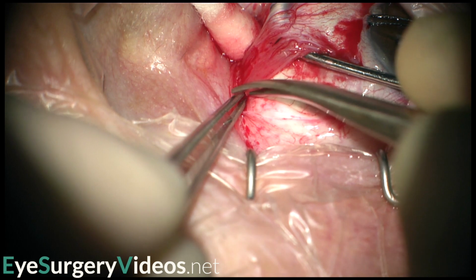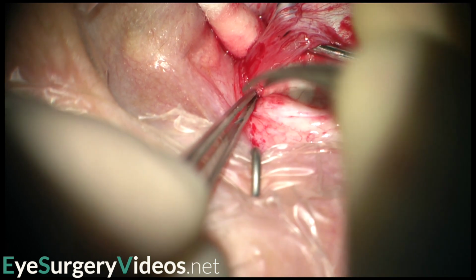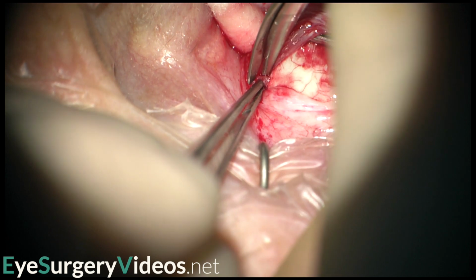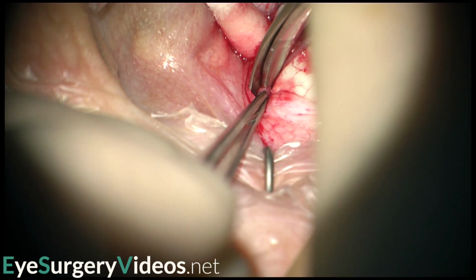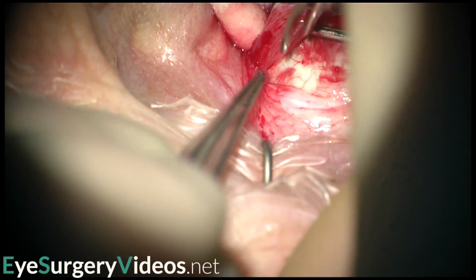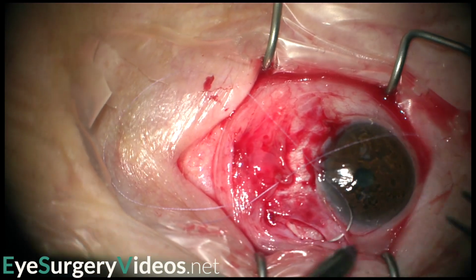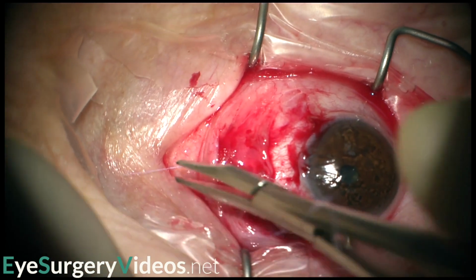In this case, a further biopsy is taken from the superior border of the medial rectus in order to improve histopathological yield. The conjunctiva is then closed using buried absorbable sutures.